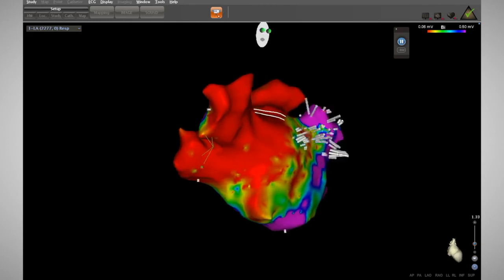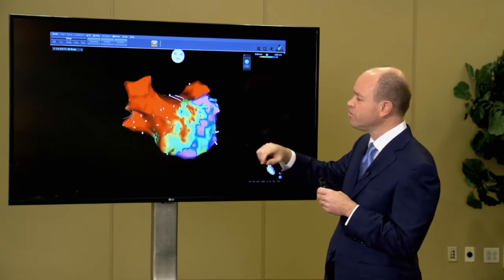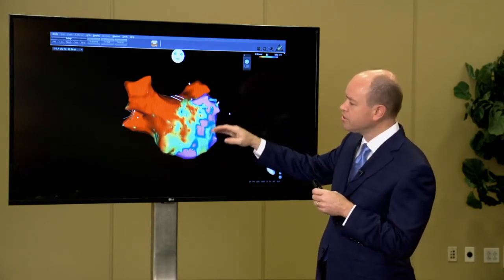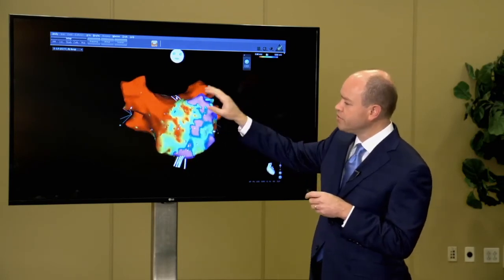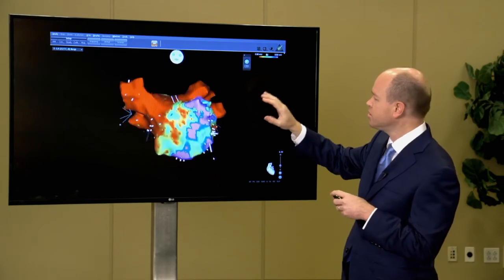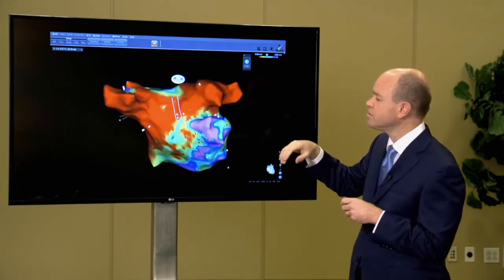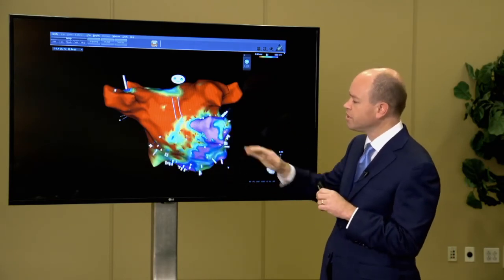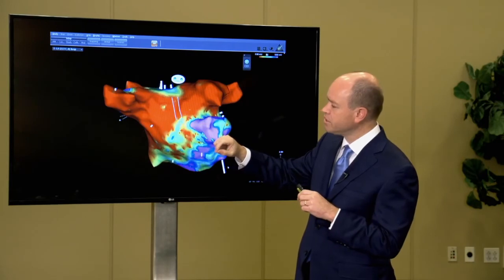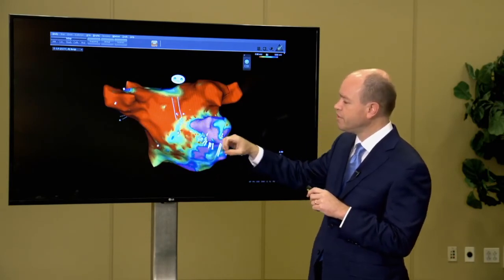these circuits. And if we focus now on what's occurring, yes, it is confirming what we saw before, activation down the anterior left atrium. There is a critical site, though. We can see the roof is fairly low voltage. The scale of voltage here is 0.06 millivolts. But within that zone of low voltage, we can see a clear breakout of this atrial flutter located right here at the anterior portion of that line.